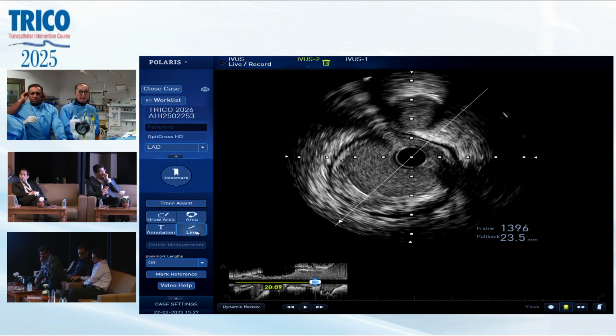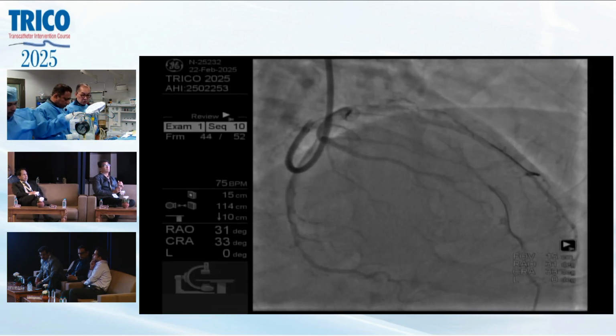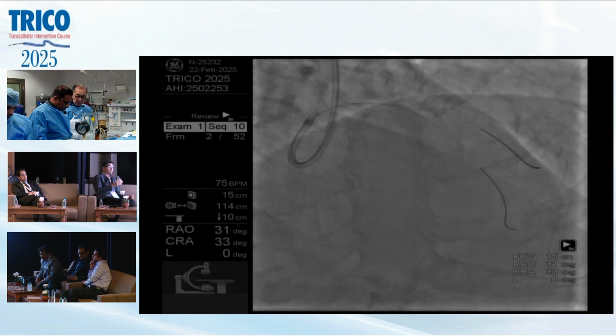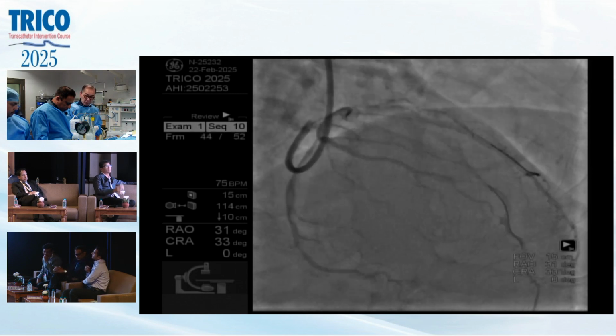Tak, do you have any preference for protection of the side branch, particularly a preference for the stent? Some stents do not protect it well, some stents protect it well. Do you have any choice? To tell you the truth, I don't have any particular choice for all the stents. With the expansion nowadays, if you have a 2.5 stent, you can expand to 4.25 most of the time.